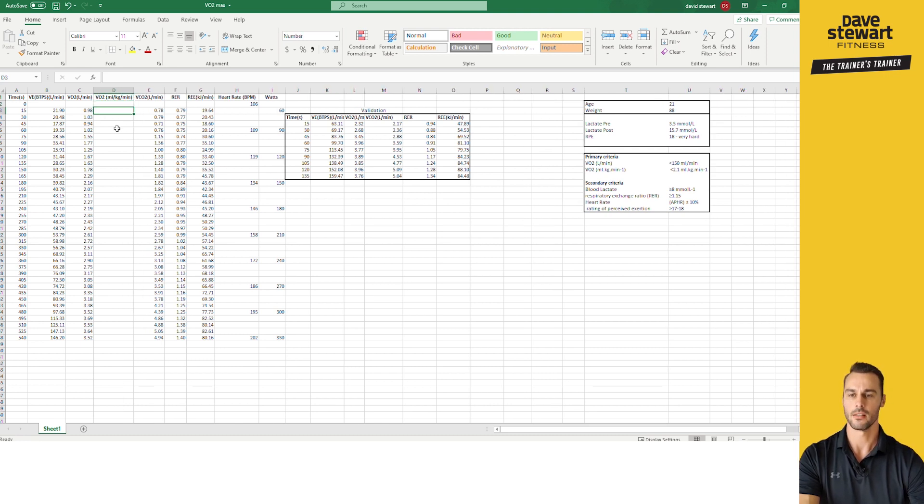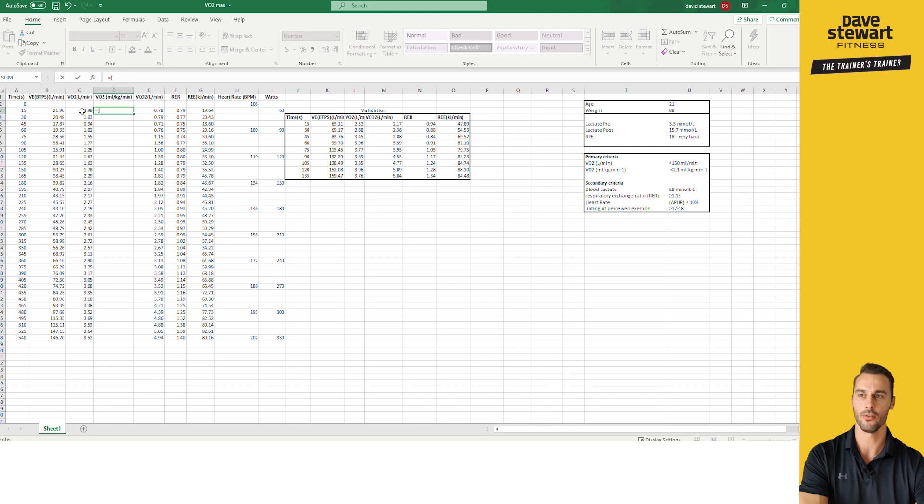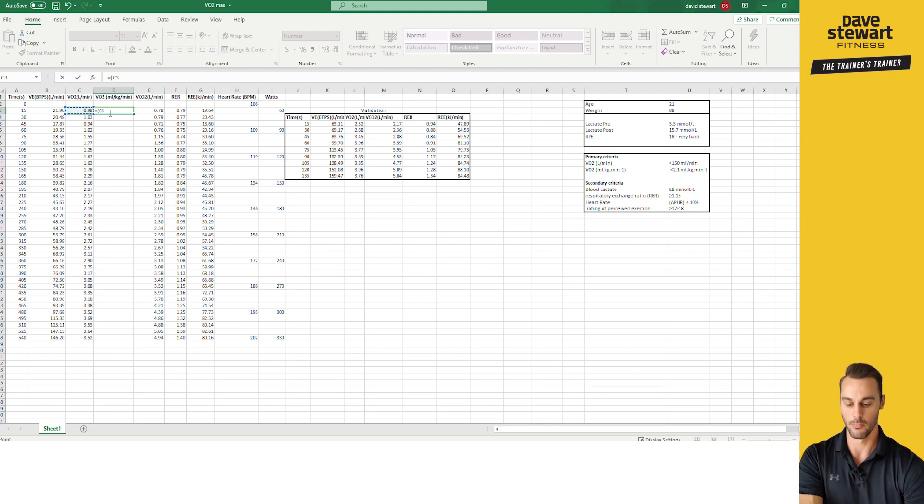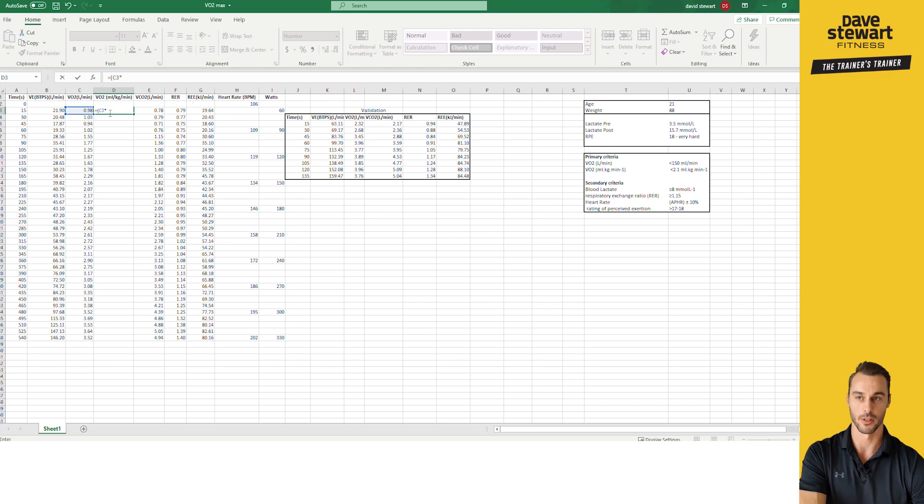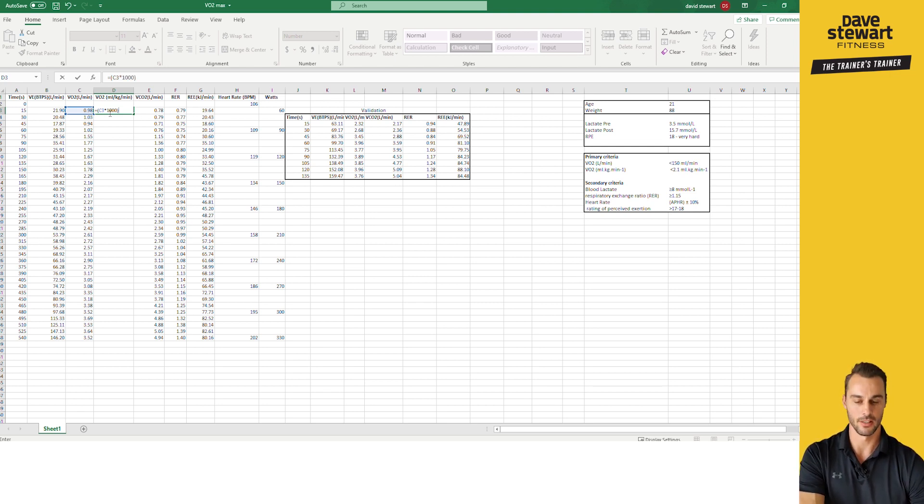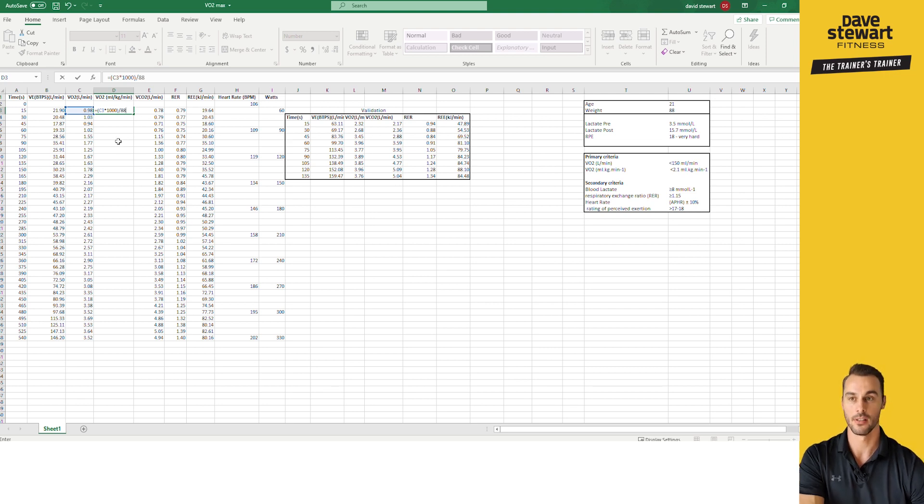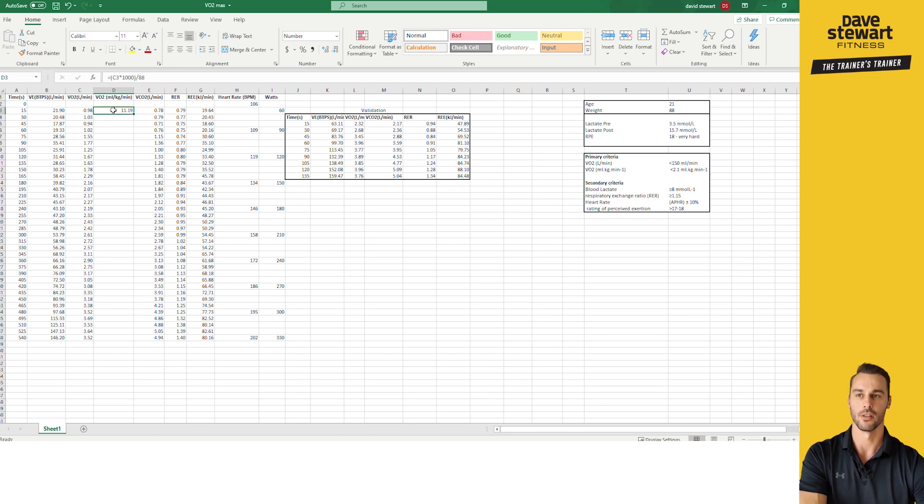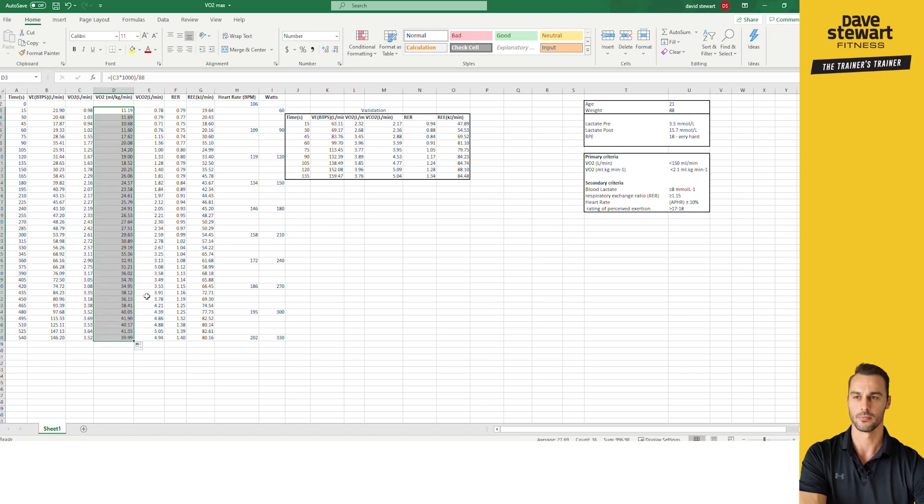So this is the first thing we're gonna do. To make an equation start in Excel, I'm gonna press equals and then open the bracket. So I'm gonna pick the cell that the absolute measure is in, so that's the liters per minute, and then to go from liters to milliliters, we need to multiply by a thousand. So shift and we put a star in for multiplication, times a thousand, and then we need to divide by the body weight. And to do that, there's his weight in kilos, 88, so 88 kilos, and enter. And that is how we get the relative measure, so mils per kilo per minute. Be very wary of your units in this stuff. Then I grab that little square, and I scroll it down here to the end. So I've got absolute measures, relative measures right there.